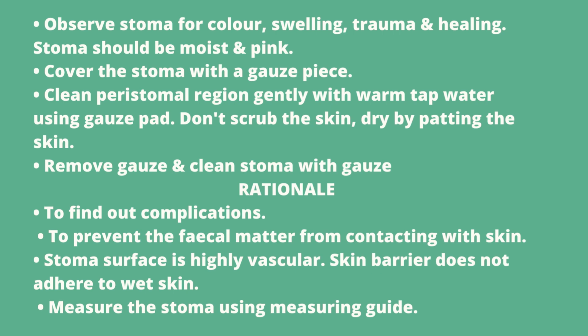Okay, why we need to cover the stoma with gauze pieces? To prevent the fecal matter from contacting with the skin. अगर वो स्किन के कांटेक्ट में आया फीकल मैटर, तो उससे क्या होगा, इन्फेक्शन बढ़ने के चांसेस जरा ज्यादा होंगे. So in that time what we have to do, cover the stoma with the gauze pieces. Okay, clean peristomal region gently with warm tap water using gauze pads. Don't scrub the skin. Dry by patting the skin also.